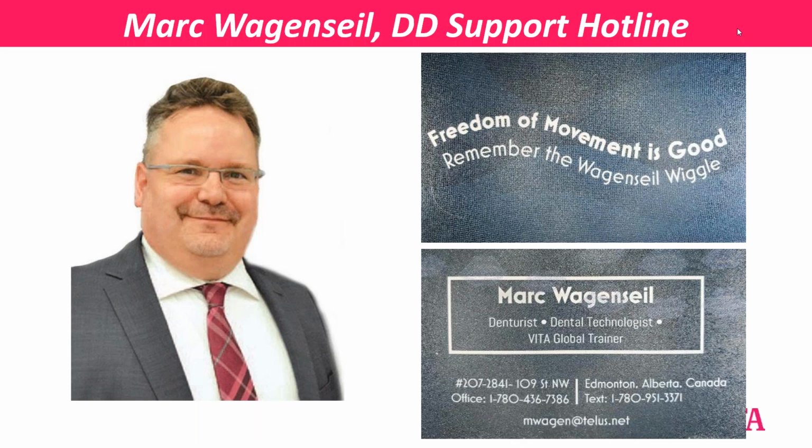You can also ask the doctor to identify, with what I've shown you on how to identify the chew cycle. You can actually draw out the chew cycles, and we've done that for labs where they've got a chew cycle and then they circle what they think the current chew cycle is. Is it more horizontal? Is it more teardropped? Then they can circle that on the prescription form for you. So, VITA and myself and Jim can help you draft documents to try and gain that information.